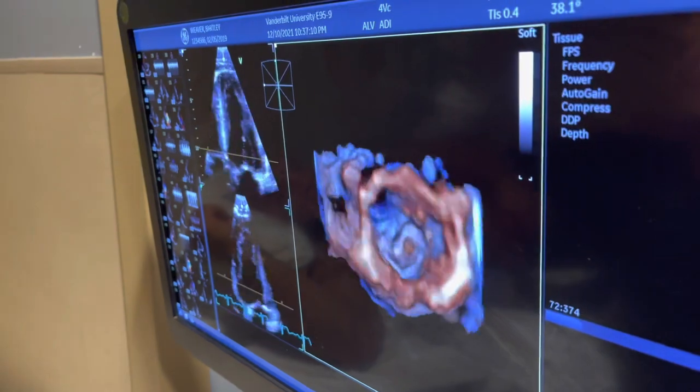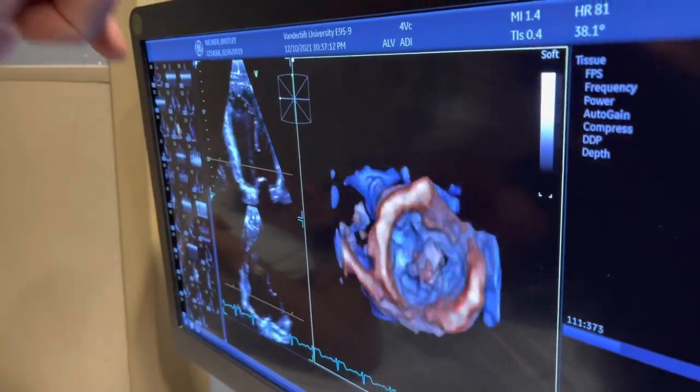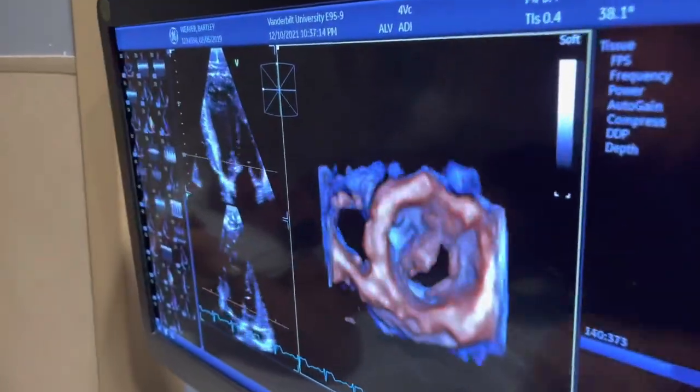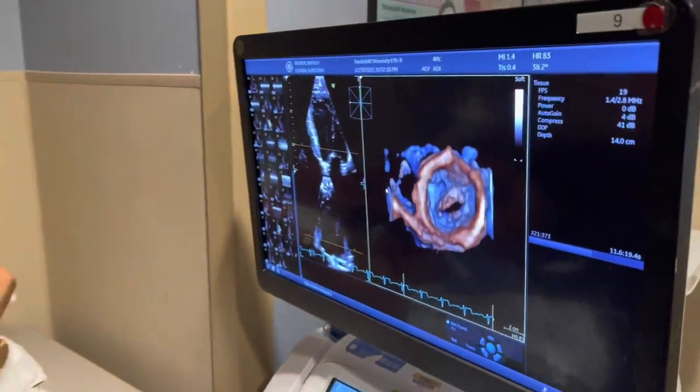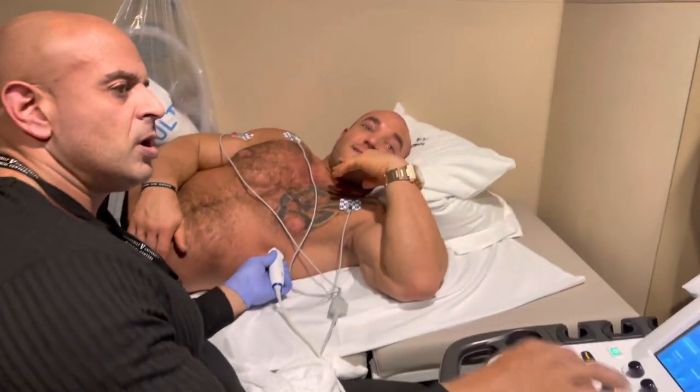Now that's a 3D image — we're looking at the valve from the top in 3D. This is your mitral valve, looking at it right from the top in 3D. Wow. Perfect.